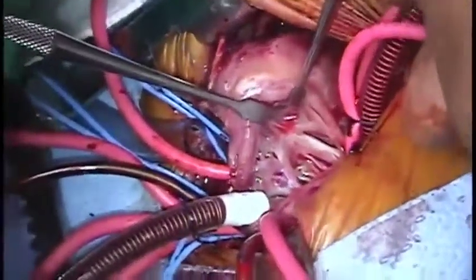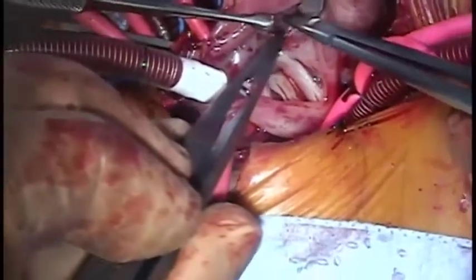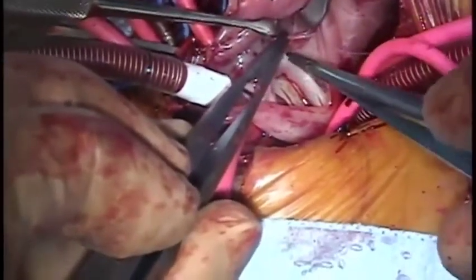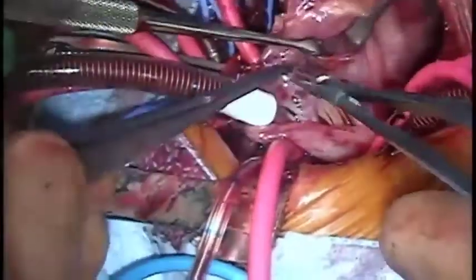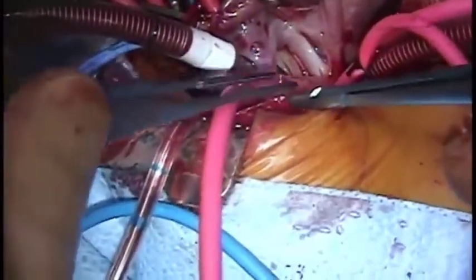The VSD is displayed and is seen to be a small inlet muscular defect. It is closed with two pleated sutures brought out through the hinge point of the tricuspid valve and then passed through the pericardium, which is then cut off to form a small strip pleated on the right atrial side.